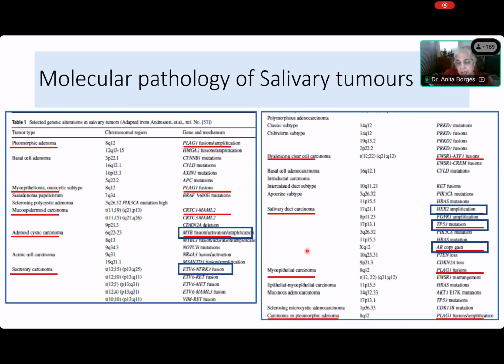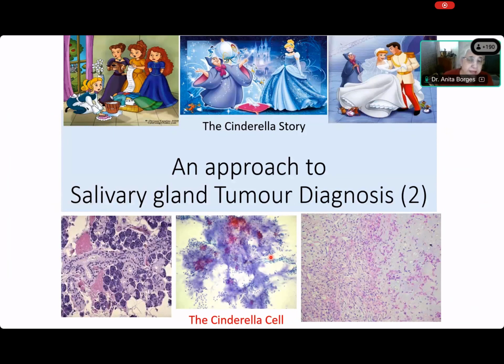Okay, so sorry, we come now to actual cases. And again, I'm going to tell you that I do not believe in doing immunohistochemistry off the cuff like that for salivary gland tumors. Almost all, 99% of salivary gland tumors can be diagnosed without immunohistochemistry.